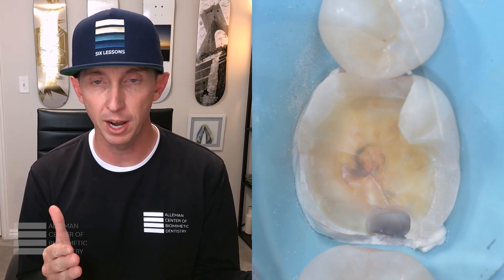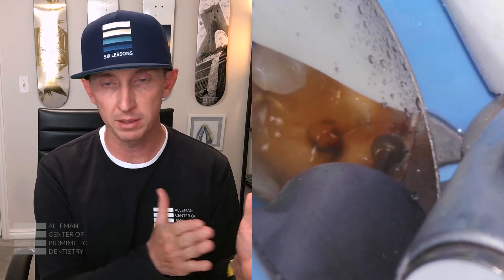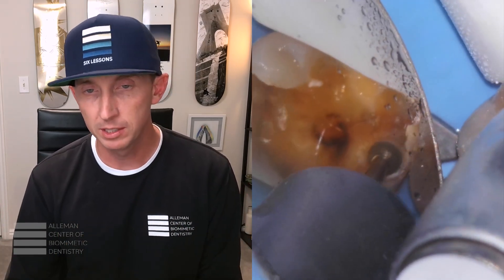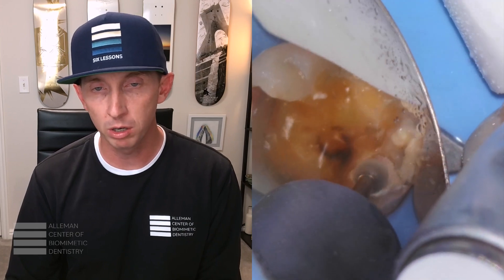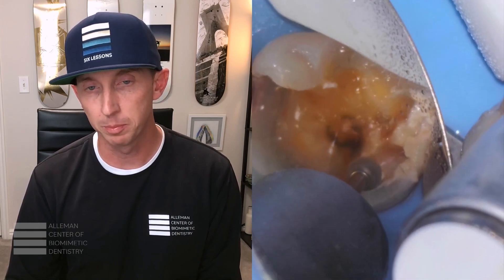Here you can see we've started to trough and remove the fracture across that line, moving buccal and lingual about the length of the bur until we no longer see the fracture present.